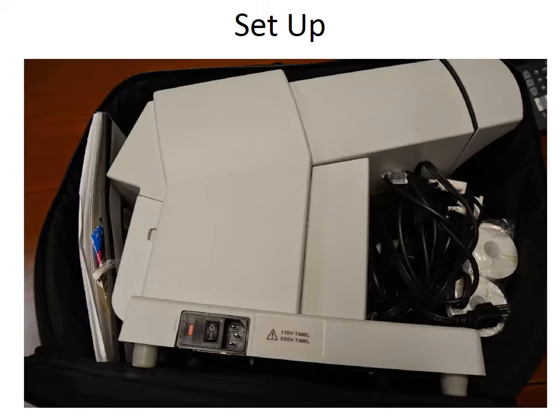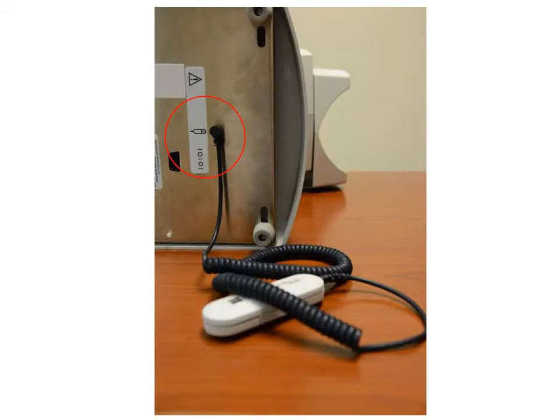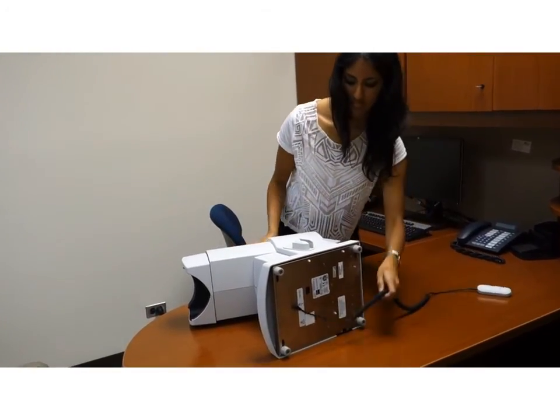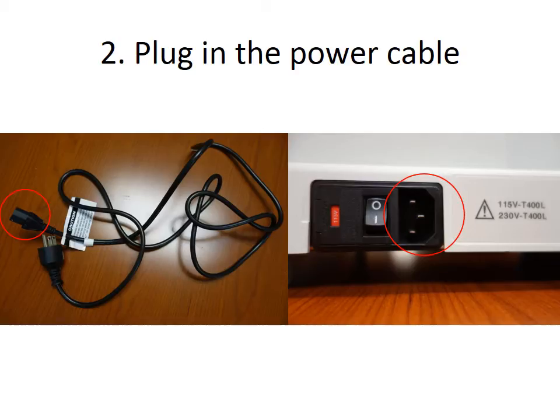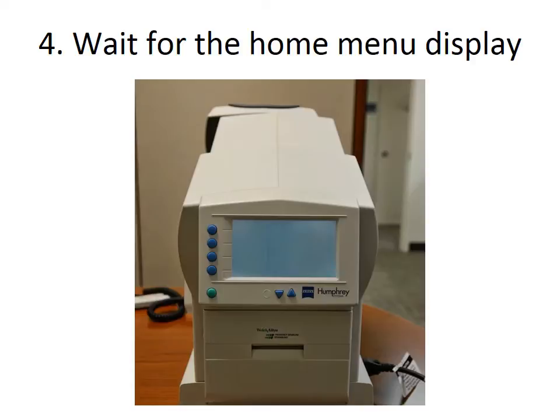The Frequency Doubling Technology machine will come out of its carrying case. The first step will be to plug in the responder cable. Tilt the perimeter over to expose the underside of the machine and plug the responder cable with the stimulus button into the designated slot. Then flip the machine over so that the patient can use it. Plug the power cable into the machine and wall. After turning on the power button, a double beep will sound and the home menu will be displayed on the screen.